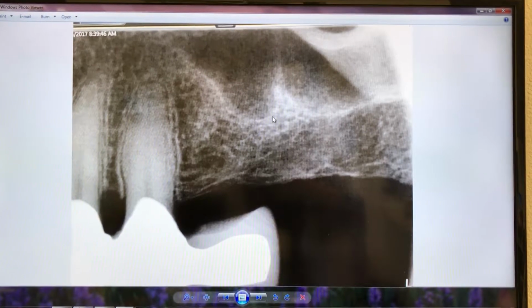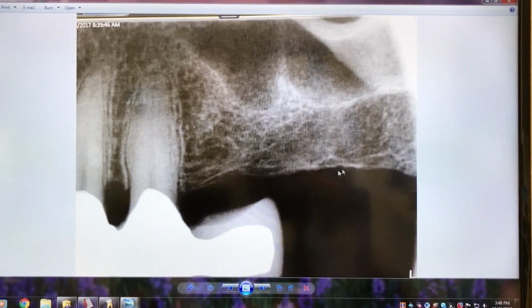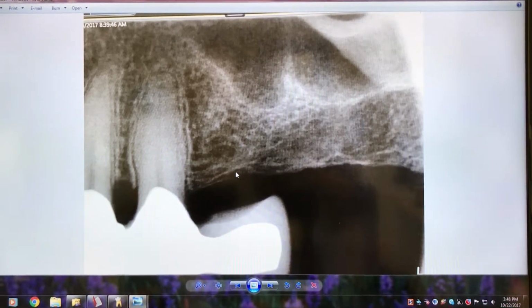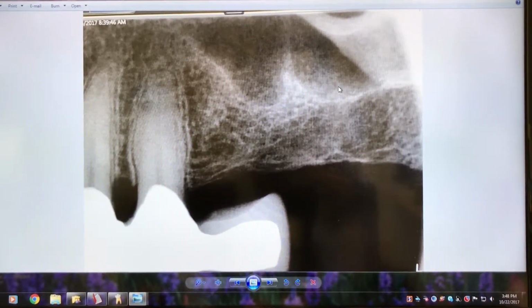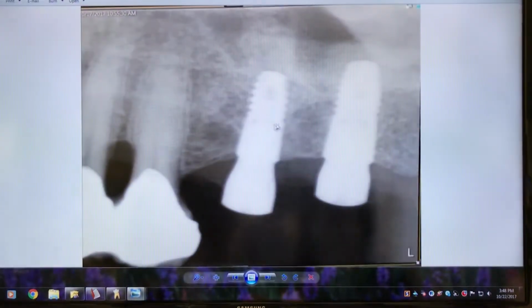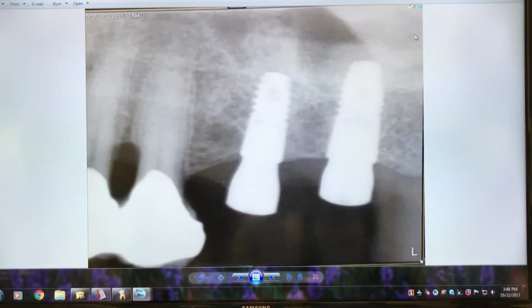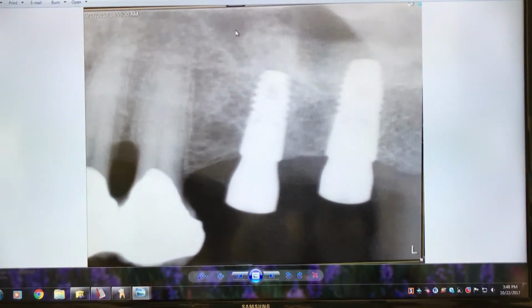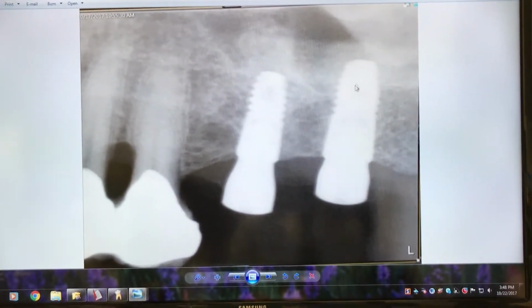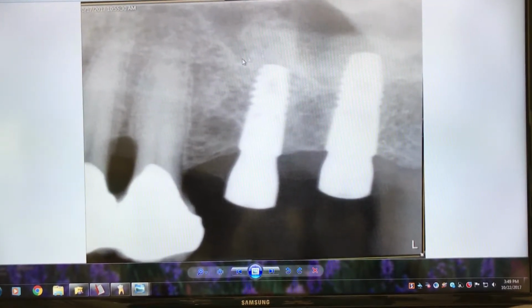So what we did, we put bone inside the sinus here through the crestal approach. So we put a hole here, and we reached this area here. You see, and we packed bone through that opening. You see, this bone right there. And then I was able to place these two implants all within the bone.